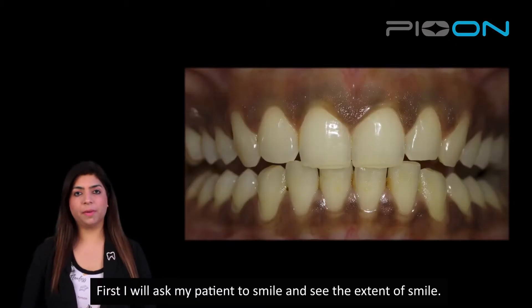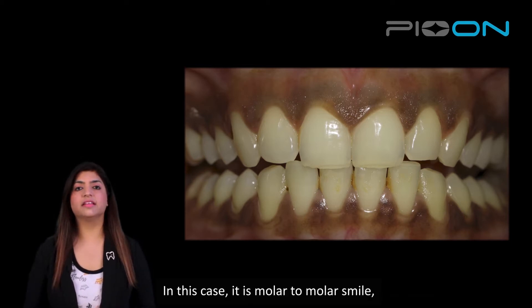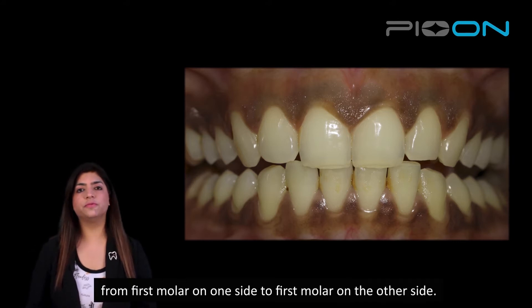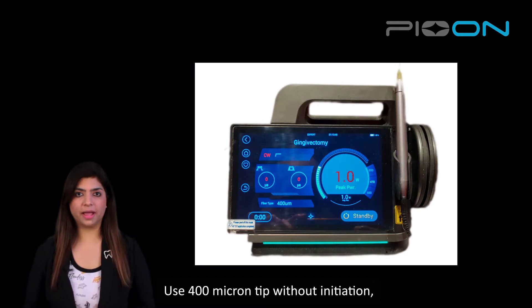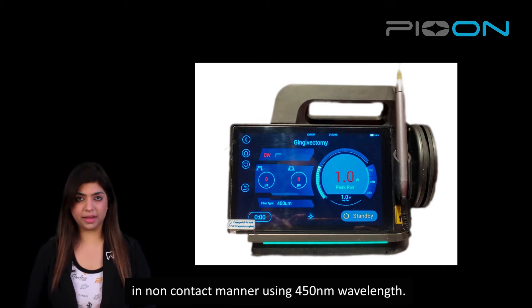First of all, I'll ask my patient to smile and we will assess. In this case, it is a molar-to-molar smile, so I will include the gingiva from first molar to first molar on the other side. I will anesthetize the area using topical anesthesia, and use a 400 micron tip without initiation, without activation, in the range of 1 to 1.5 watts in a non-contact manner using 450nm wavelength.